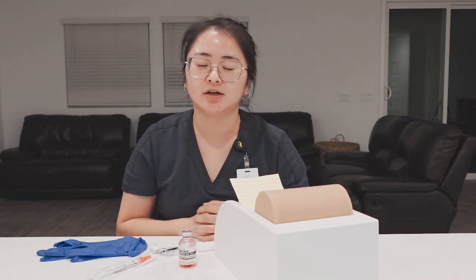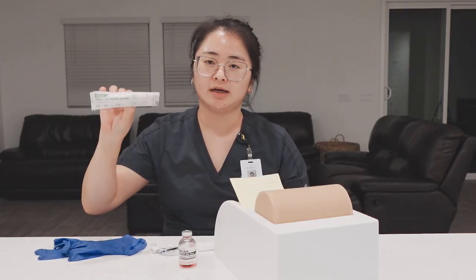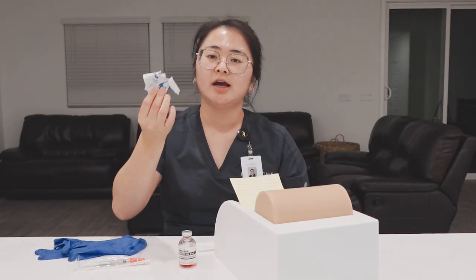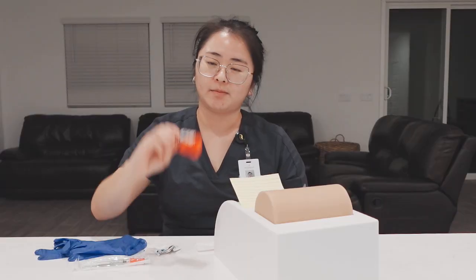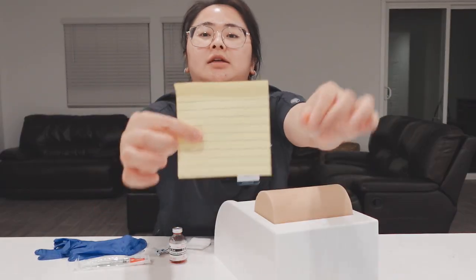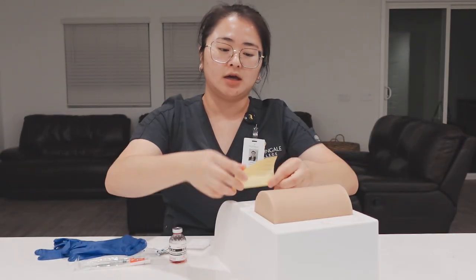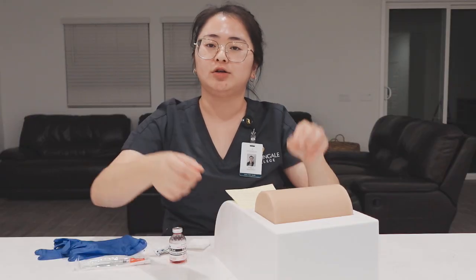I'll be doing the skills video administration of subcutaneous injection. I'm wearing the correct uniform. I have my badge. My supplies consist of a pair of clean gloves, my needle and syringe, my alcohol prep pad, my vial, my gauze, and the sticky note. The sticky note doesn't have anything on it. That's what I'm showing you. I only have it so I can show you a close-up of the dose later on.